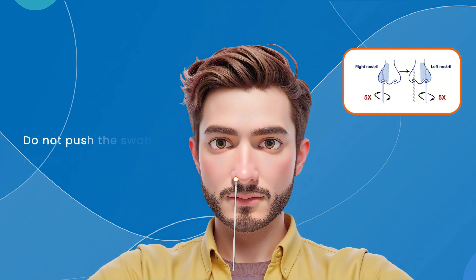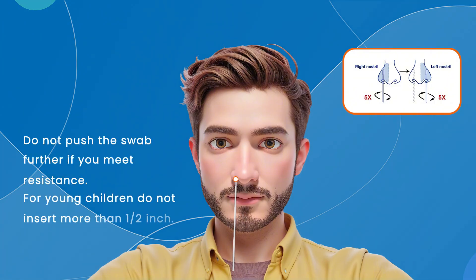Take out the swab and rotate it five times in each nostril. Ensure an adequate sample is collected from both nostrils. Please note, do not push the swab further if you meet resistance. For young children, do not insert more than half an inch.